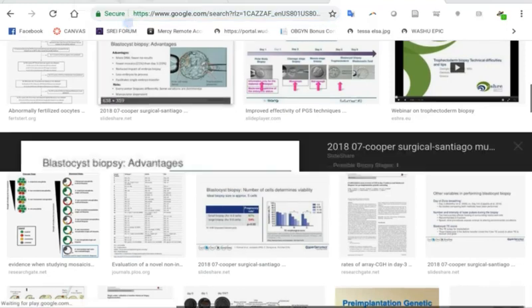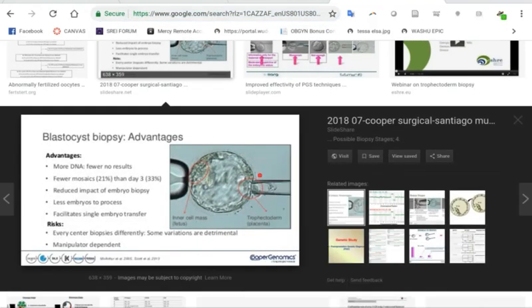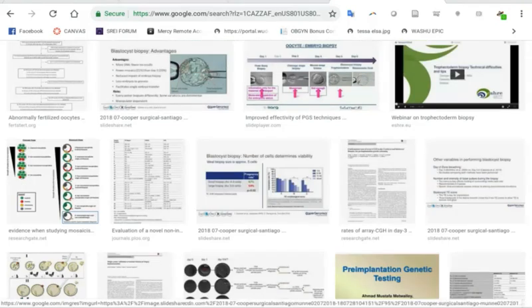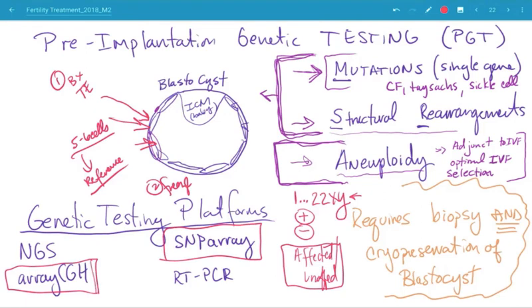Here's an example of what a trophectoderm biopsy looks like. The embryo is being biopsied — a laser is used to make a hole in the zona pellucida, and then the trophectoderm cells are gradually suctioned out. Remember, the inner cell mass ultimately becomes the fetus; the trophectoderm ultimately becomes the placenta. So you're taking the cells that will become the placenta, amplifying them, and running them on an array — either a SNP array or a CGH array — to look for gains or losses in chromosomes. Many reference labs have now moved to next-generation sequencing.